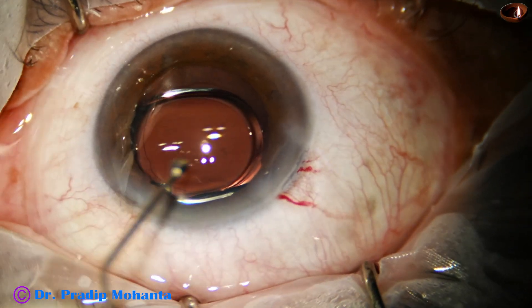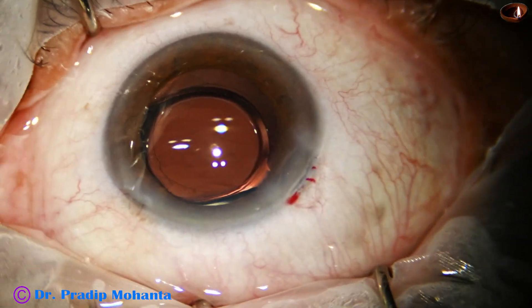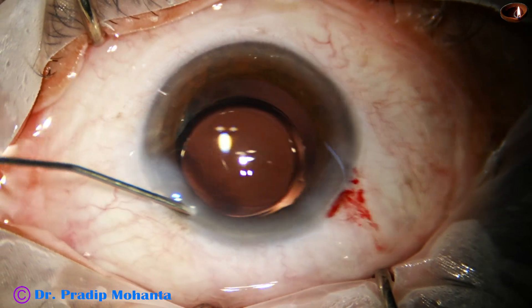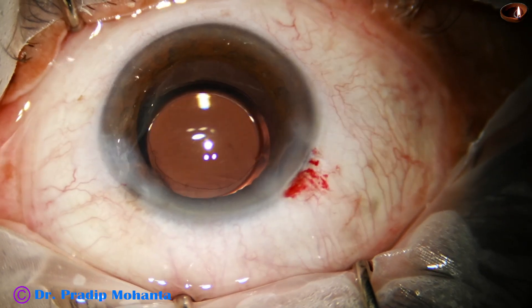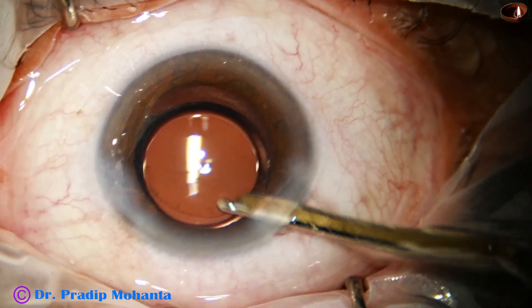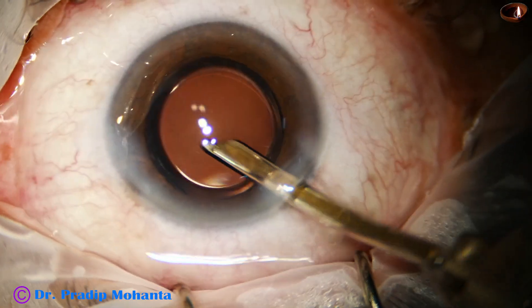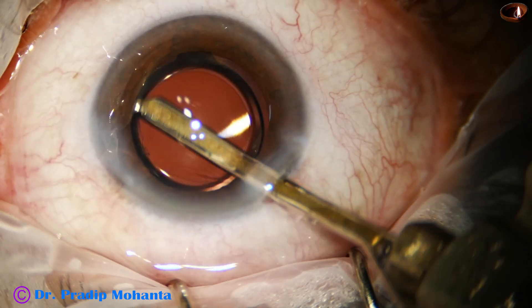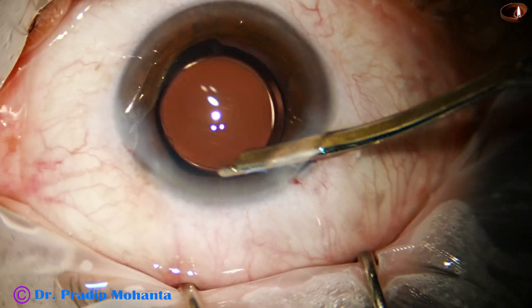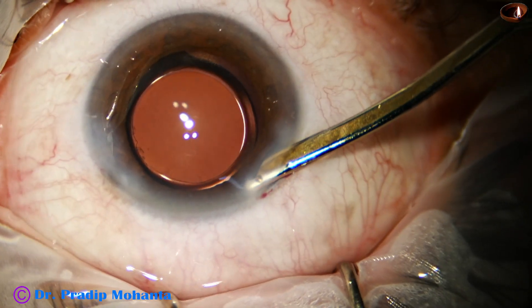Both haptics are in the capsular bag. This is a bit of moxifloxacin. The side port is closed by corneal stromal hydration. This is the final lavage of the anterior chamber — any viscoelastic sticking to the corneal endothelium is removed. A final polishing of the posterior capsule is done sometimes, and any lens fiber sticking in any area is removed.